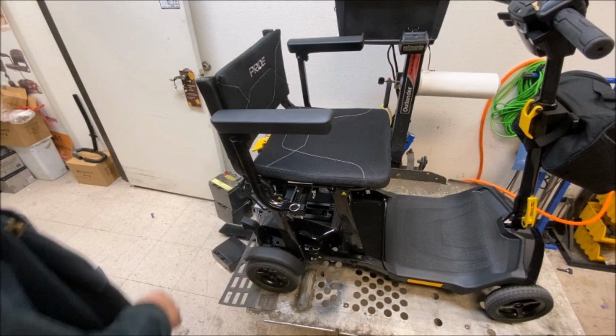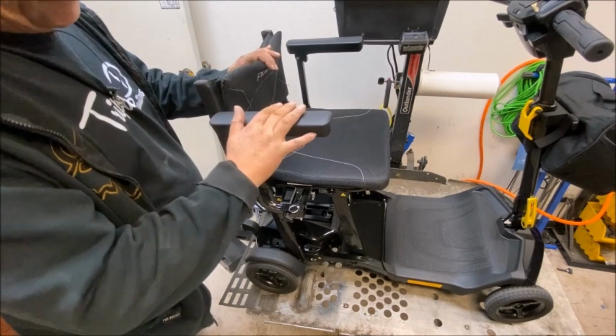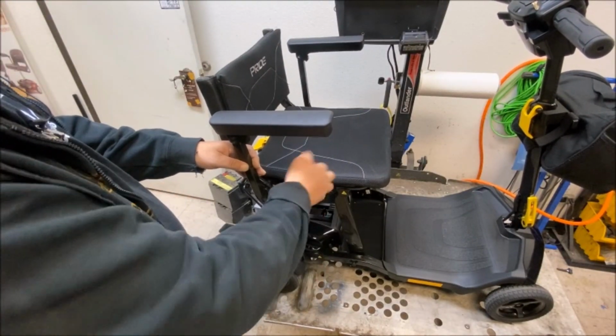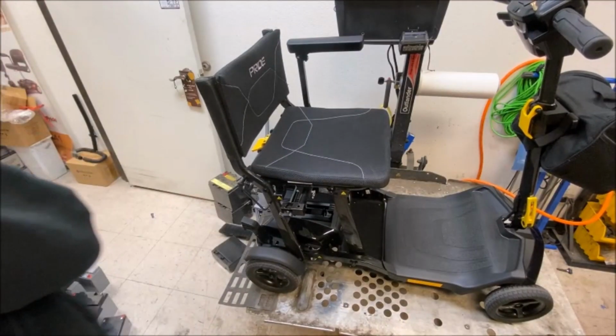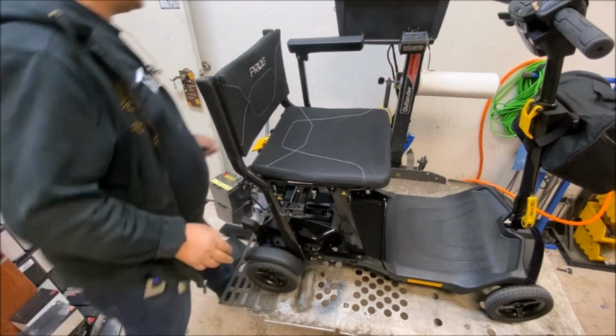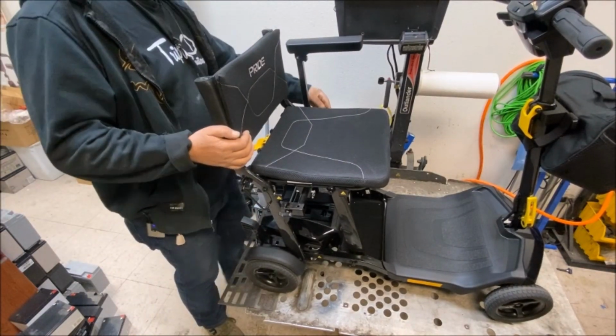Okay, so the first thing I'm going to do is remove the armrests, because I don't need those getting in the way, and they just pull off easy enough. No need to release the brackets. Hope you can see that all right.